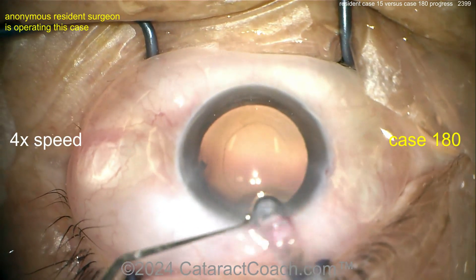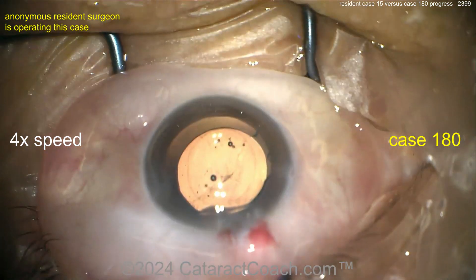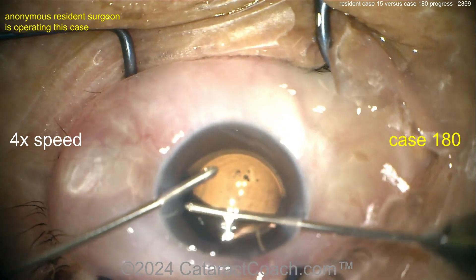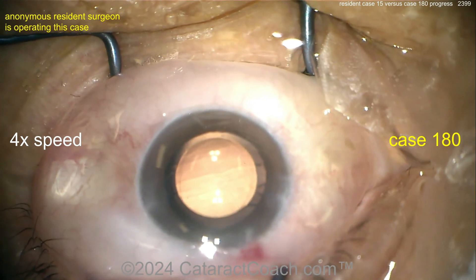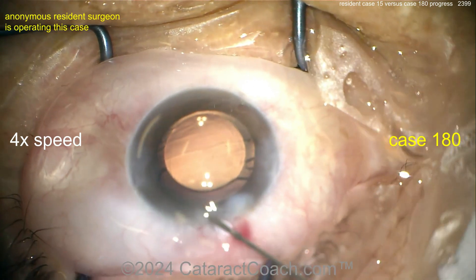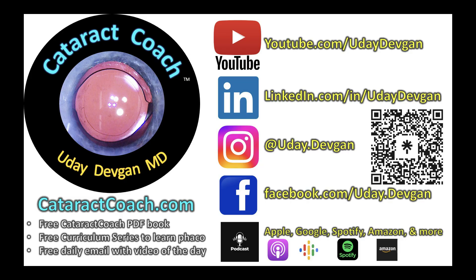Tell the patient: lift your chin — 'levante la quijada por favor y mantenga los dos ojos abiertos' — lift your chin up and keep both eyes open. Injecting that lens into the capsular bag — that looks pretty good. Dialing it into position, we can judge the rhexis size now. Case 15 had too small a rhexis and that's why it ripped. Case 180 — that's a pretty good rhexis. With a six millimeter optic, that's probably a five-ish millimeter capsulorrhexis, not bad at all. You've got great hands. Fix the incision, make sure the rhexis is good, and in case 180 get that head position right — lift the chin up, iris parallel to the floor. Check our podcast and visit CataractCoach.com for a free PDF book and full curriculum.